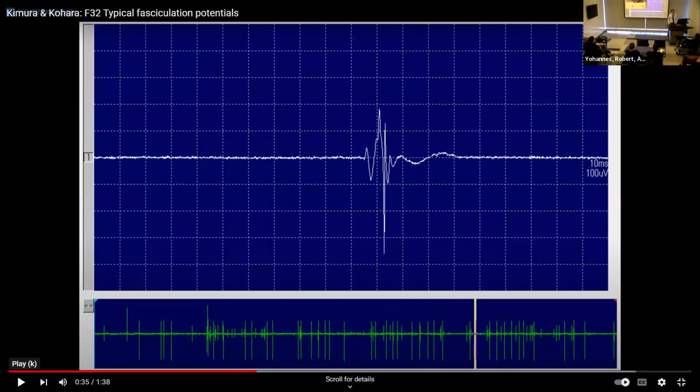There we go. Look how bizarre it looks. First of all, I hope you appreciated the low thump, like a drum with a low frequency beat to it. It's this popcorn popping, here and there, and sometimes in a cluster. But look how bizarre it looks.